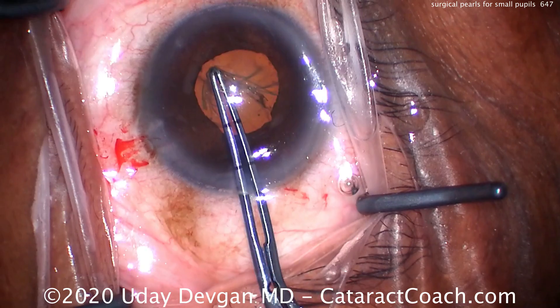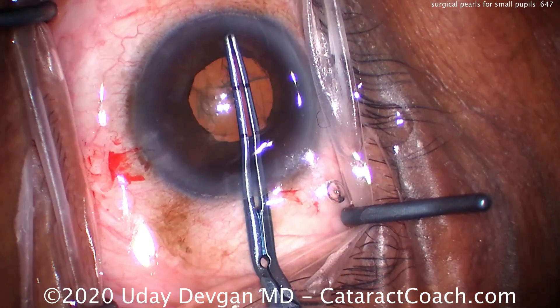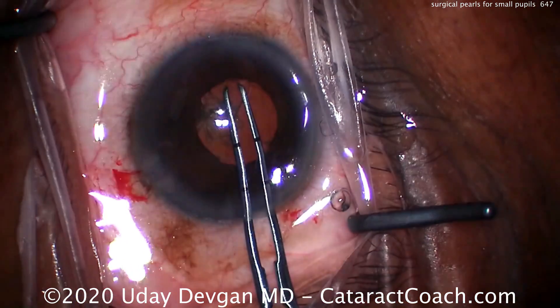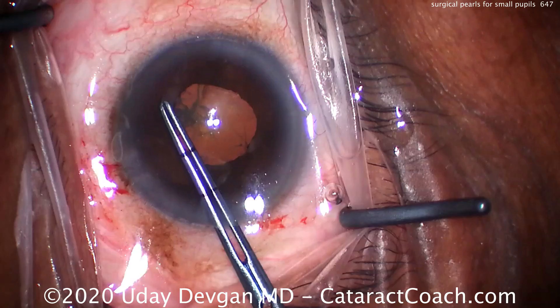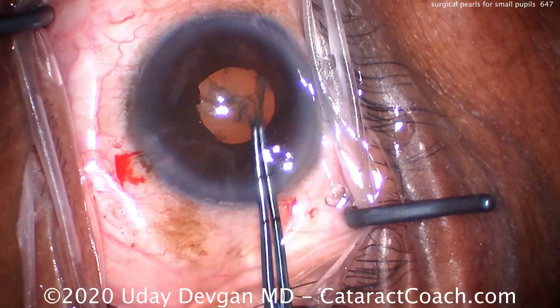The very edge of the capsularexis is now under the iris tissue. You don't directly visualize it at all, and that's okay. You know where it is. You've got this — not a big deal. You've done this a thousand times, probably 10,000 times. There's a nice capsularexis.